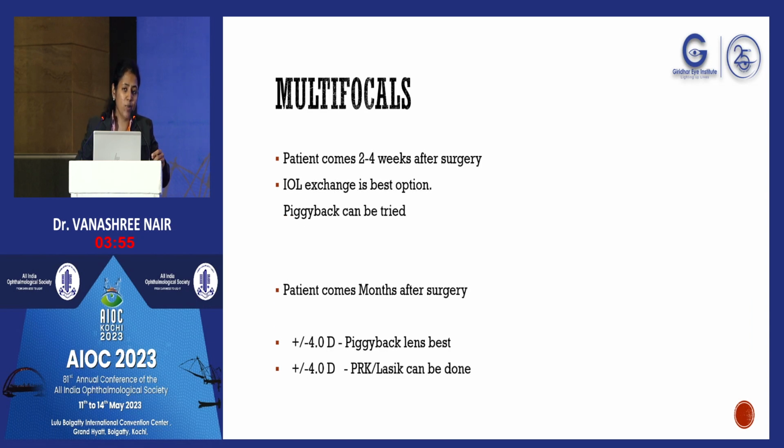Multifocals, again, it is better if the patient is not happy because of glare and halos, then you may have to replace it with a monofocal. But if it is about the refractive outcome, then it is better to go for an IOL exchange. Piggyback can be tried, but not a really good option. And if the patient has come many months after the surgery, then it would be better to go for a piggyback lens, but we'll have to really rule out the way the refraction may turn out in the end.